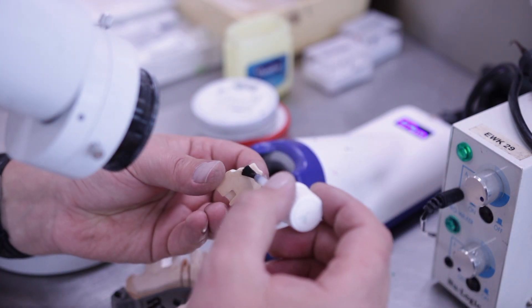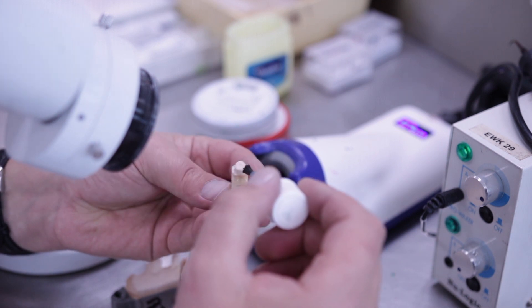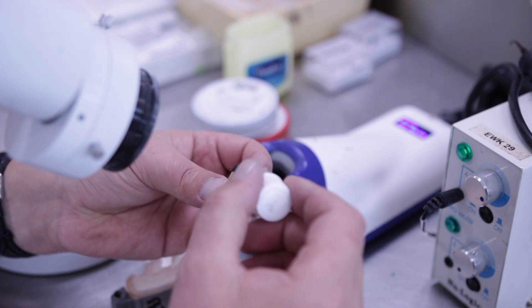Apply a thin layer of clear spacer all the way down to the cervical margin. Make sure the spacer has the correct consistency.